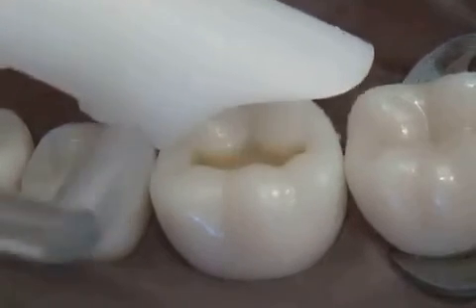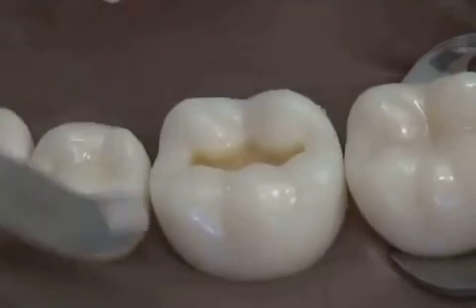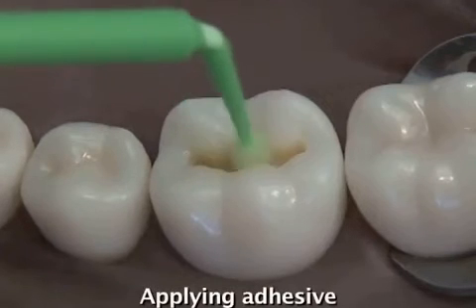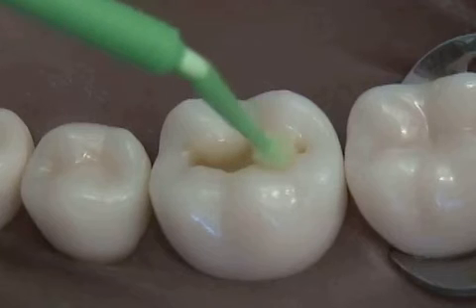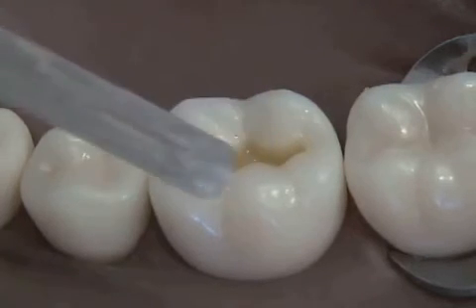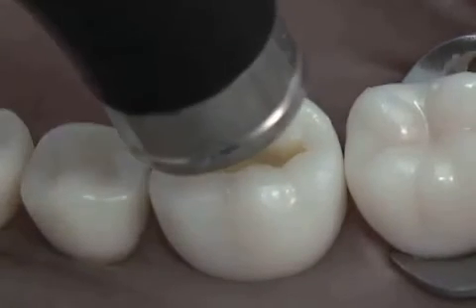You can gently dry the tooth, but leave the dentin somewhat moist so as to not collapse the collagen fibrils. Apply prime and bond adhesive with a microbrush. Gently air thin the bond to evaporate the solvent and then cure for about 10 seconds.